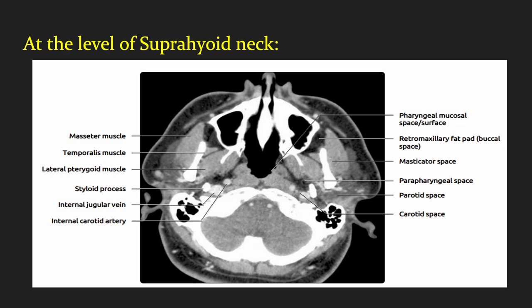This is the axial section taken at the level of the suprahyoid neck. Here we can appreciate the masticator space. Posteriorly to the masticator space we have the parotid space. In the middle we have the pharyngeal mucosal space which continues below as the visceral space. Posteriorly we have the perivertebral space which splits anteriorly into the prevertebral compartment and posteriorly as the paraspinal compartment. We also have the carotid space, and in front of the carotid space is the parapharyngeal space which has fat as its component.